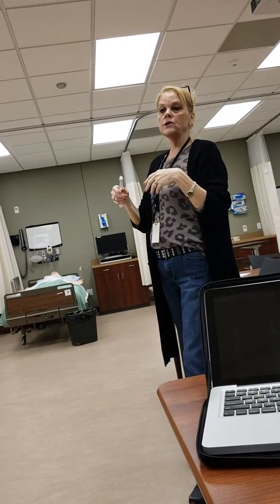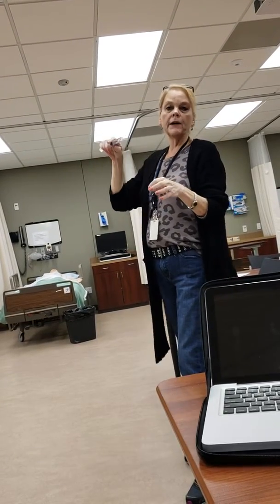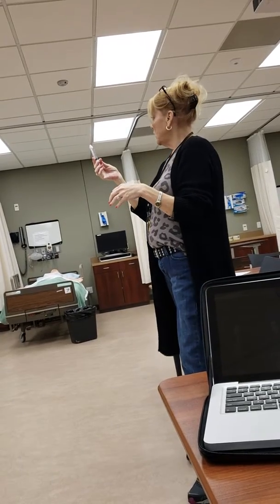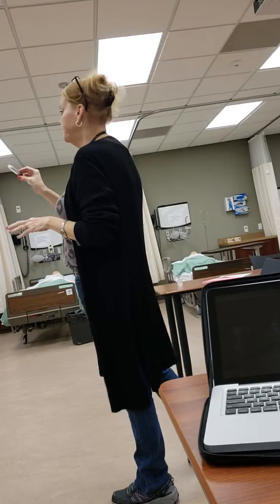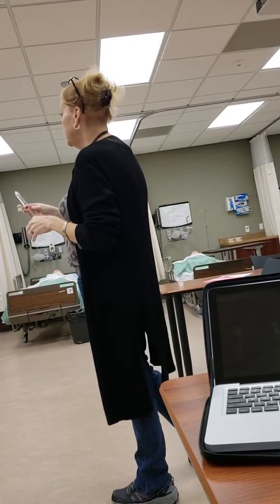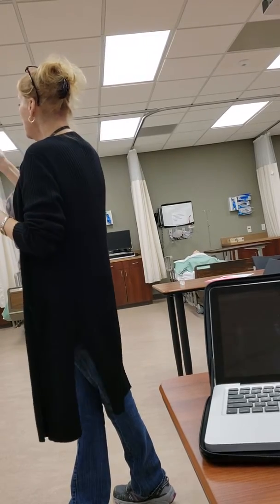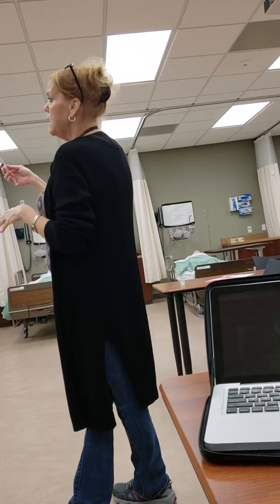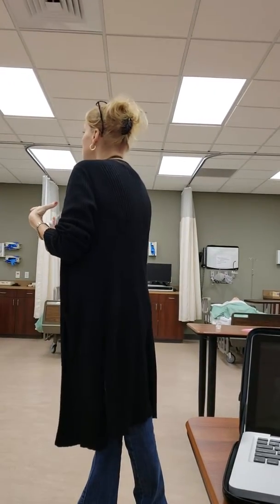The other way that you can do it is you can draw it up in a larger syringe and then pull back your saline in order to dilute. The dilution isn't that big a deal. 3 to 5 is fine. I usually do 5 for everything. It's just a safer diluent, unless there is a medication where it specifically says that it has to be diluted in 10.